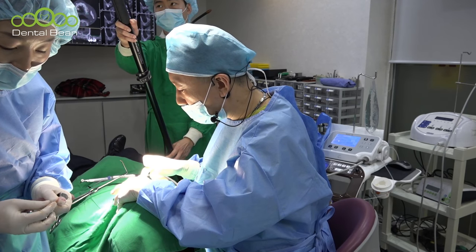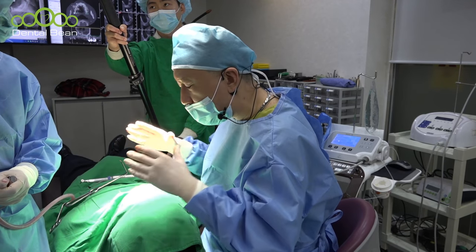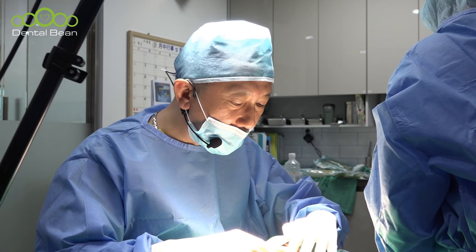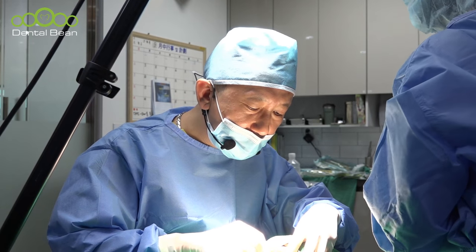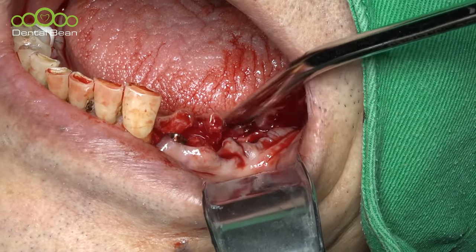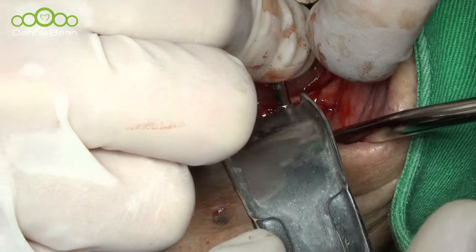That's right. For the Dentium implant, the supracrestal margin area is the beveled area, the smooth surface. Actually, for this implant, a little bit deeper is better. So after I finish this one, I will try a little bit deeper. So the same level is better. Like here, you mean? Yeah, but I think the initial is too high. Yeah, that's what I thought. I just exposed only the machined beveled area. Yeah. Thank you.